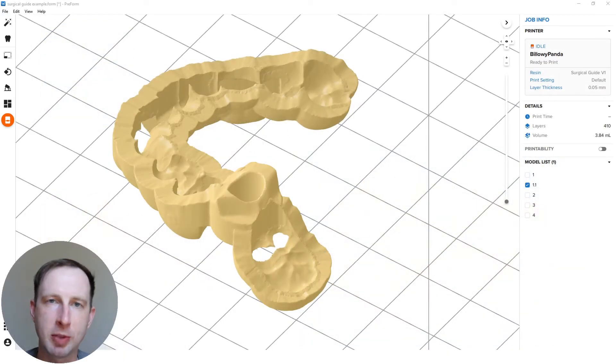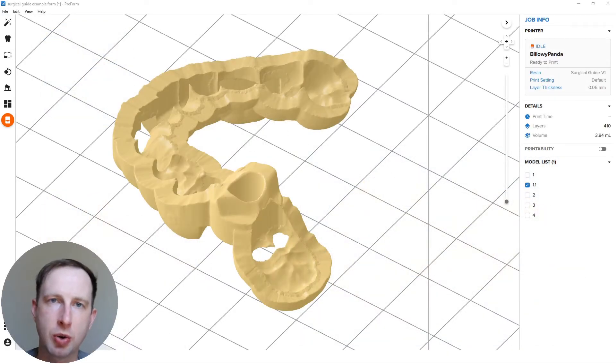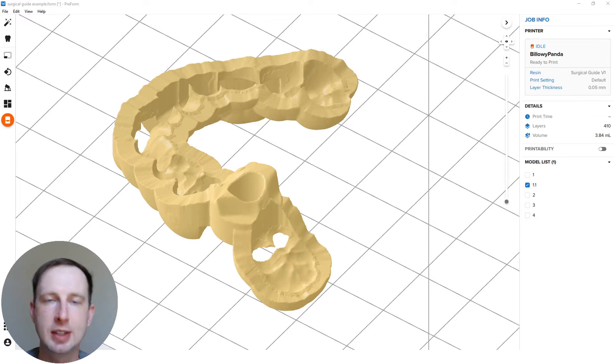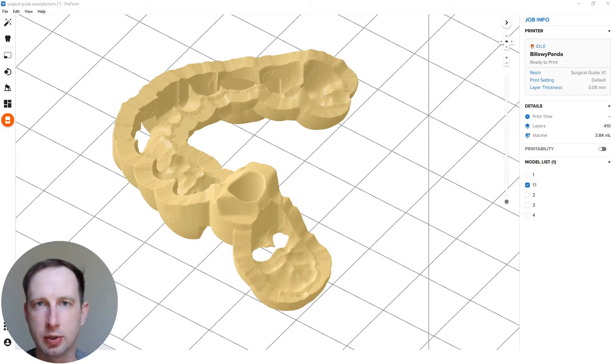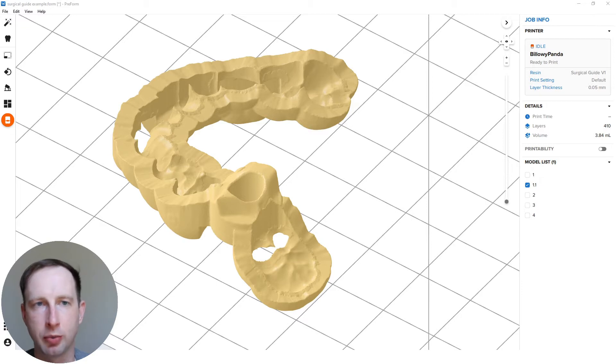Hello, this is Sam from Formlabs. In this video I'm going to show you how to easily and quickly set up surgical guides, drill guides in our PreForm software, job setup software.